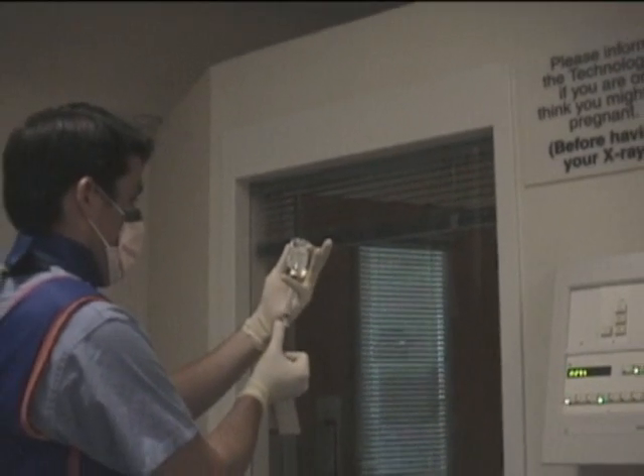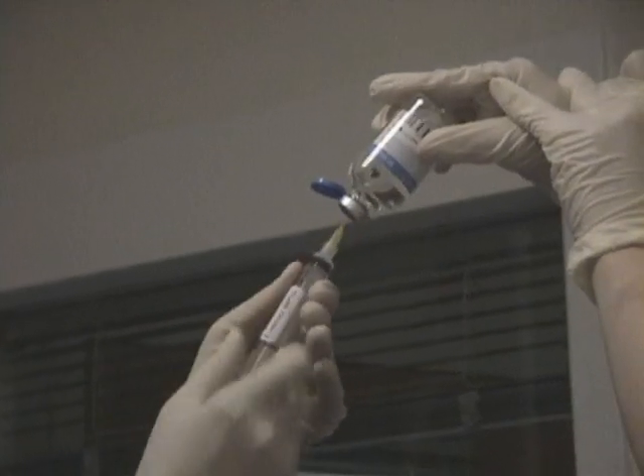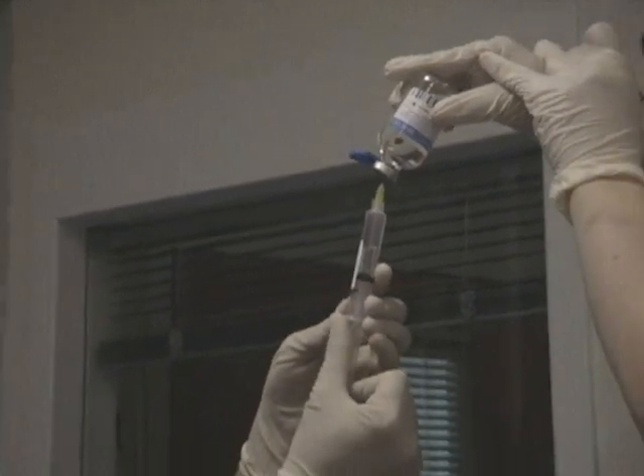First, draw back about 3 cc's of lidocaine into the 3 cc syringe. Then, draw back about 5 cc's of Conray into the 5 cc syringe.